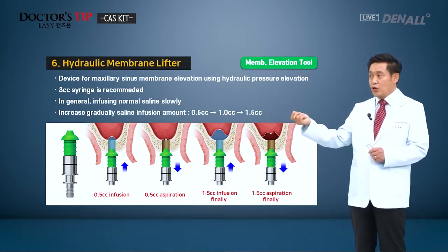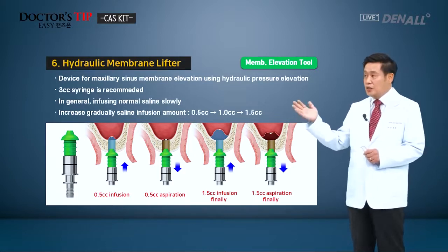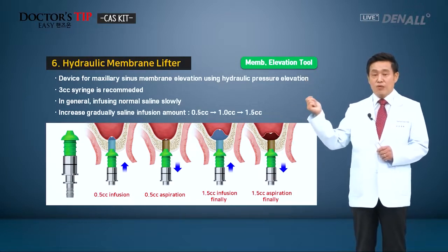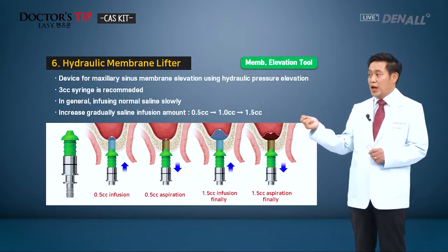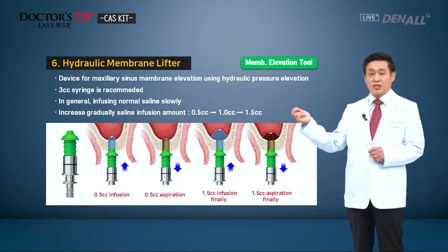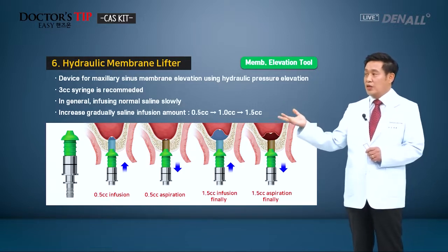But if you do it like this, 0.5 cc is infused and then aspirated, you will be able to feel the negative pressure. Whether there is a membrane tearing or not can also be detected that way. After that, 1 cc is infused and aspirated, followed by 1.5 cc infusion, etc.